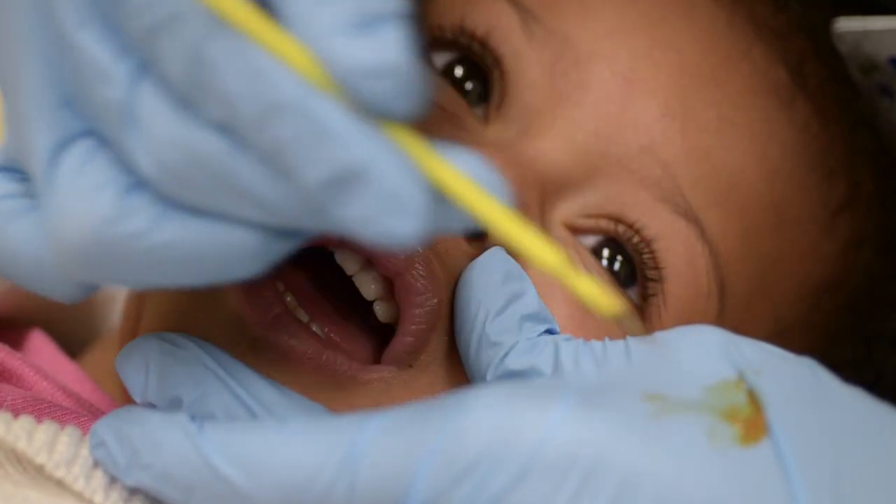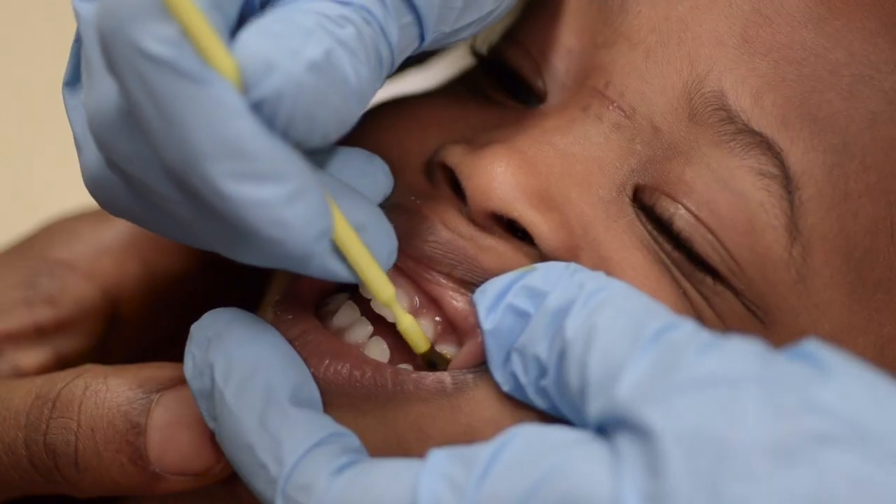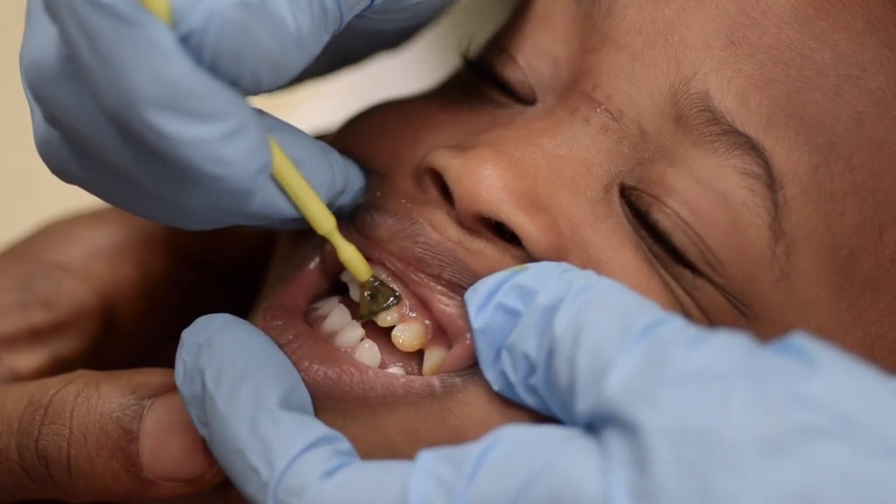Most varnish comes with a yellow tint, so you can keep track of where you've already applied it. You only need to apply a thin coat of the varnish, and you don't need to use all the varnish provided.